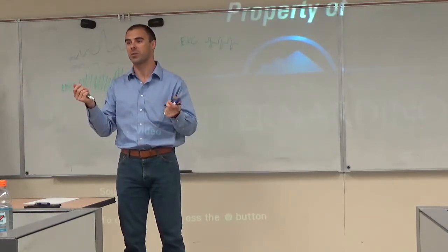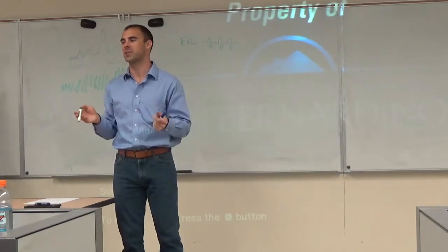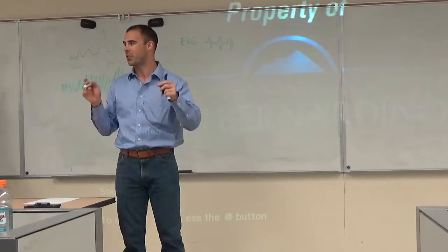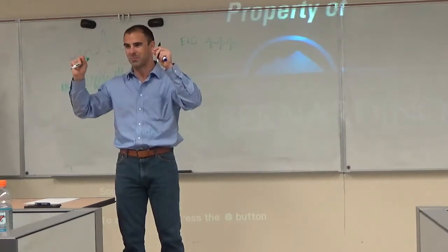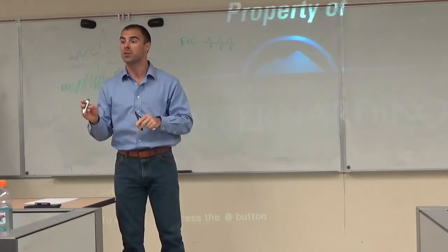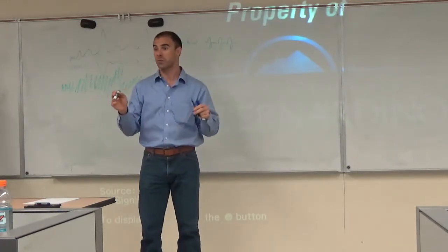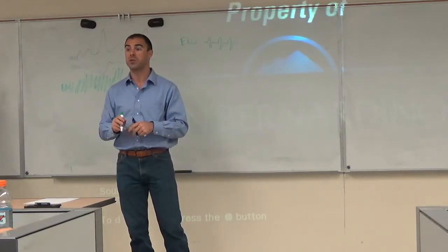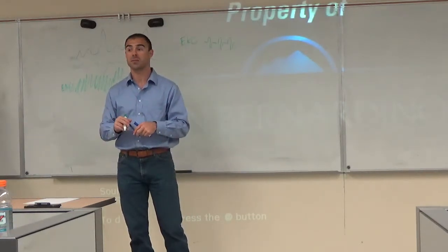That's the H, right? And of course that's reflecting some muscle activity too, because you have the muscles on the side of the eyes making that happen. But the eyes themselves are moving this time. So if you're reading left to right on the screen, or you're looking around, you're going to have these artifacts, HEOG, these saccades.